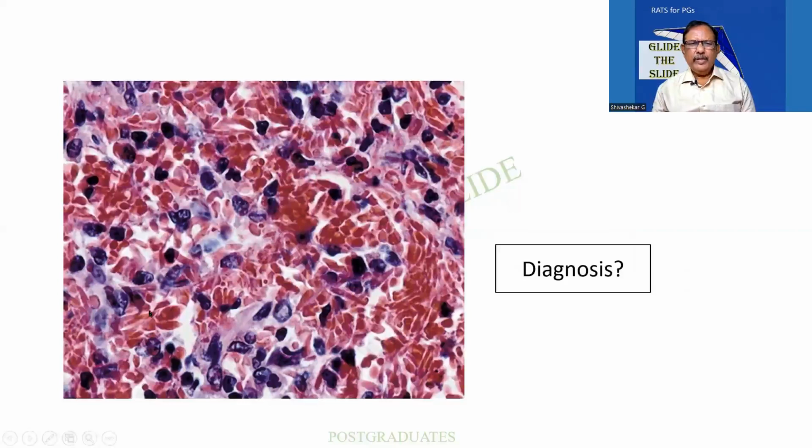If you are not convinced, look at this. Look at the elongated cells. Sometimes hematological diagnosis will be given to us in histopathology. There are a good number of examples. We shall be seeing them in future. So there is a clog and some of the cells are elongated, not many WBCs. So the diagnosis is sickle cell anemia.